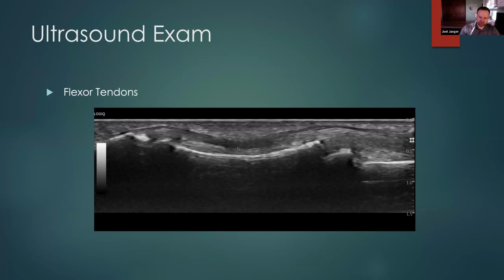The other thing we were assessing for is underneath this tendon. We're looking for any gap with fluid, and also looking to see if this is compressible. That's another comment on the light touch I was referencing earlier, using a lot of gel or that water bath so you can float this. If we're compressing a little too hard, we might artificially stabilize that tendon when the pulley is absent and not doing it. So that's something to keep in mind when you're doing that assessment.